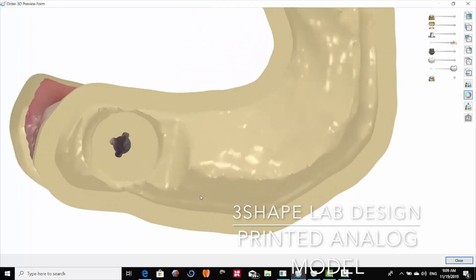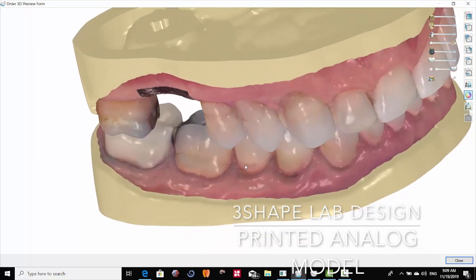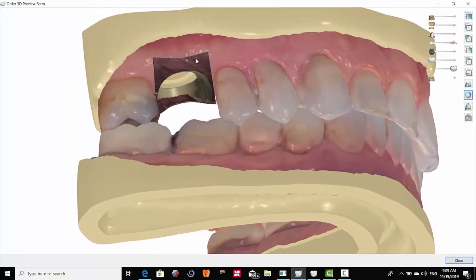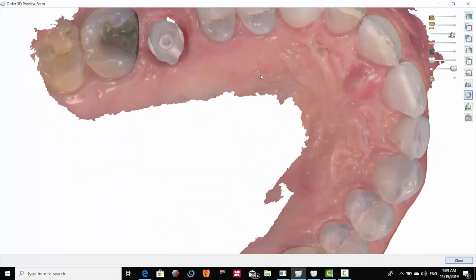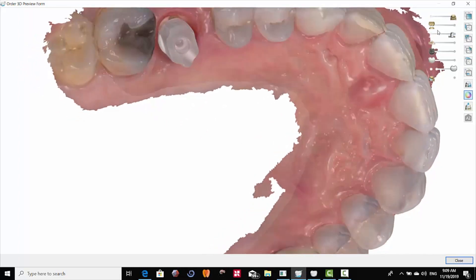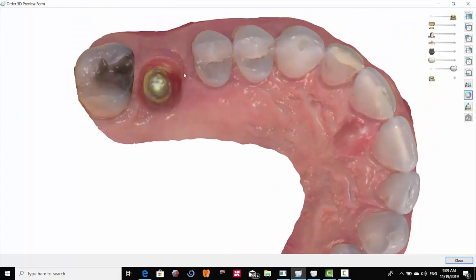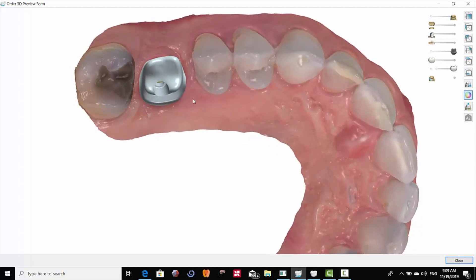I wanted to show basically what goes into a 3D printed implant analog model. You can see here this little trilobe, and this trilobe is associated with an NT Trading screw-in analog. Here's the 3D printed model — you can see a little dark portion here, which is for a separate 3D printed gingival mask. We used an NT Trading scan body, which is made out of PEEK, and you can see the gingival mask that we took of the patient where we shaped the tissue with a contour healer.